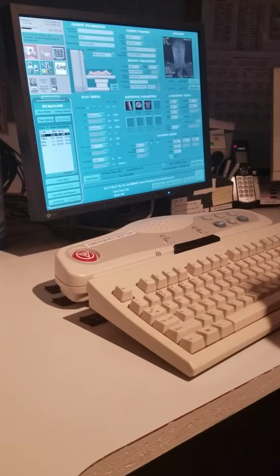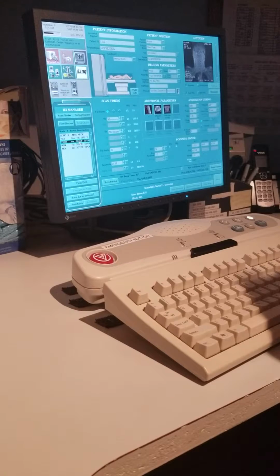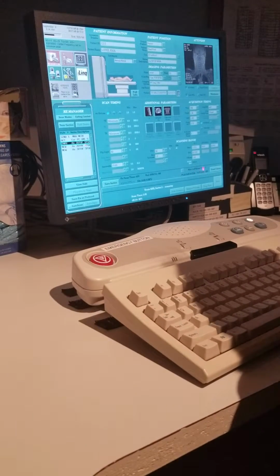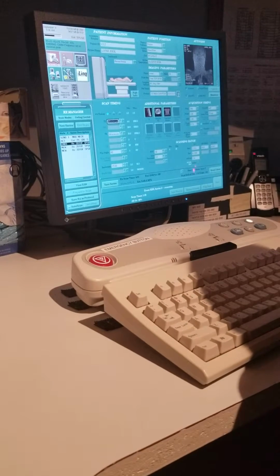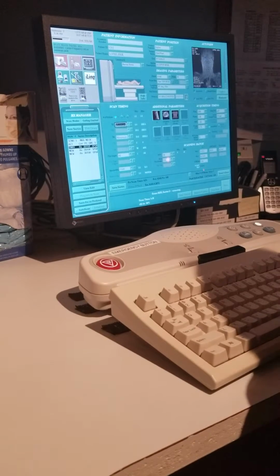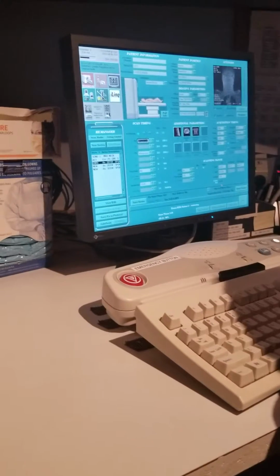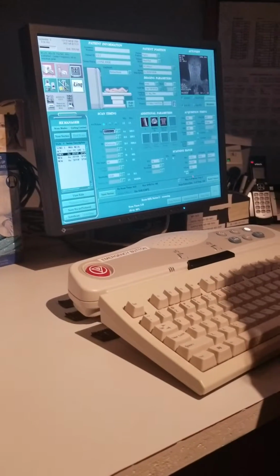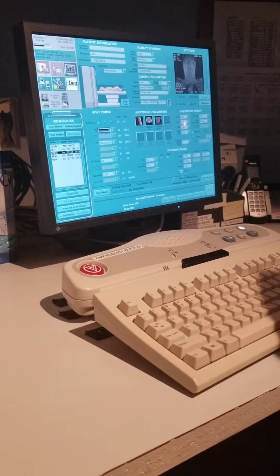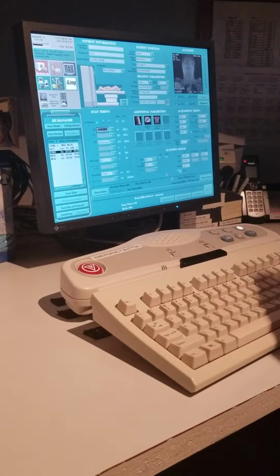Okay, so we're on the next one. Axial 2D. This is a volume scan, so the time is based on the number of slices. It's been programmed with 124 slices, which are 2 millimeters thick. Based on the anatomy, we either need more or not as much. If you lower the number of slices, you lower the scan time. And this is already at your very base, lowest, and it's still at 5 minutes long. Exactly.